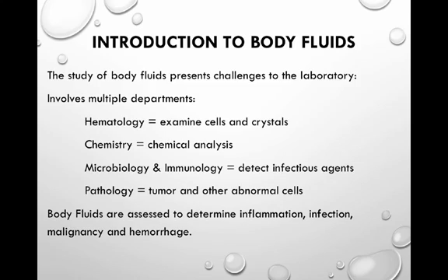Identifying and differentiating the types of cells seen in body fluids requires experience. All lab techs who perform body fluid analysis need to be able to differentiate the types of white blood cells, normal tissue cells, normal tissue lining cells, and most malignant cells from benign cells. Chemical analysis again involves things like glucose content or protein content. For example, in spinal fluid, the glucose and protein content is important, and that can be an indicator of the presence of a potential organism in the sample as well.